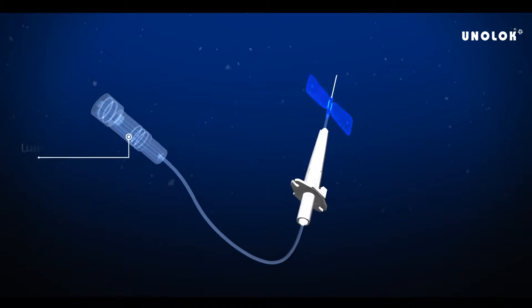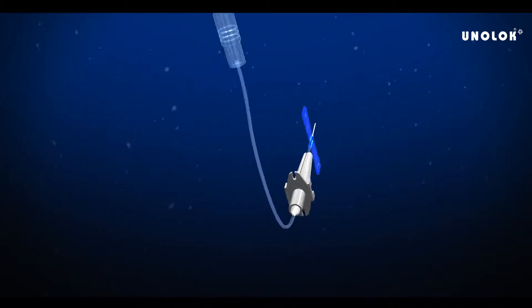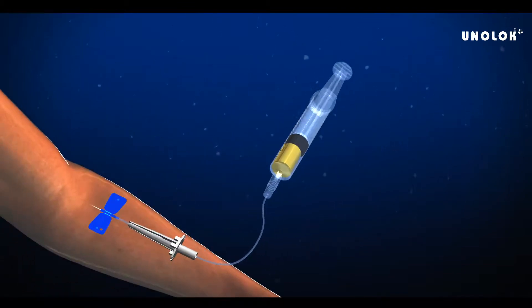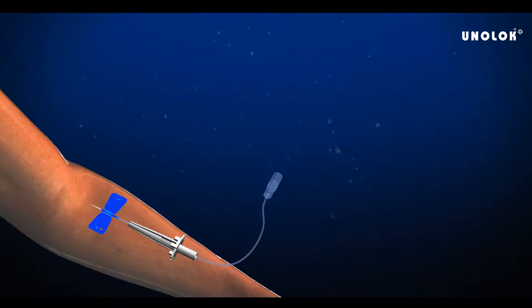A transparent lure adapter allows visual monitoring of the flow of the medicines. The device includes a rigid PVC lure lock connector that ensures a secure fit and prevents accidental leakages.